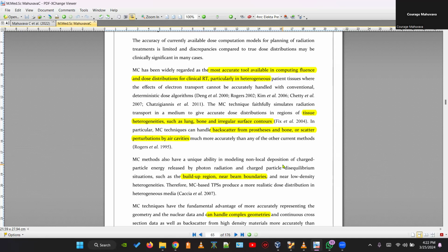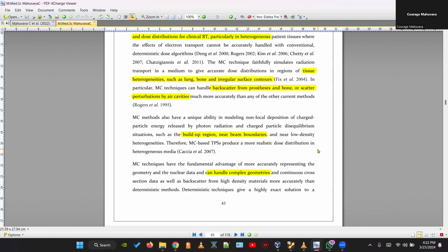So they come in different materials, shapes, and sizes, and the dose perturbation they cause is quite different from patient to patient. So we can't really put a general assumption on how much the dose is perturbed. Particularly if the prosthesis is made of metal, there's going to be considerable hotspots at the interface between the metallic object and tissue. So we need to know how much dose is delivered at different areas within our beam path.